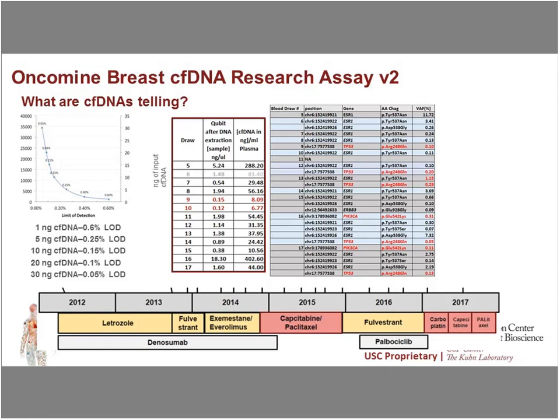In our single-cell morphology characterization, although we don't see a correlation between ER expression and a specific CNV subclone, we did notice that cells expressing ER decrease to 10% under the ER deprivation therapy with fulvestrant. But we cannot find a good explanation with CNVs, but we have a feeling that the ESR1 resistant mutation might be the reason. So we started to detect that mutation in both single cells and plasma samples.